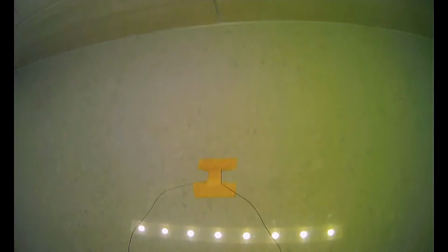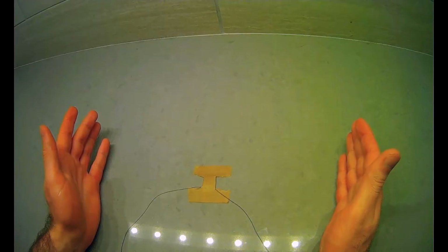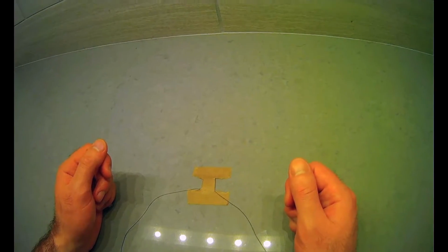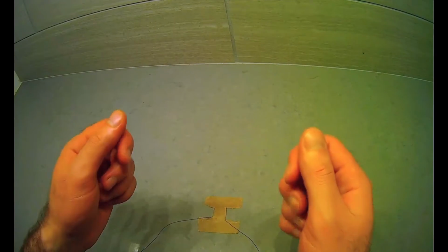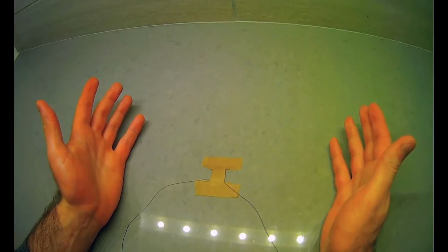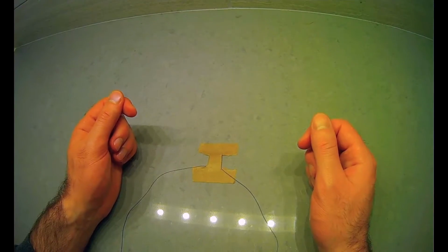The answer to this is that how you want to tie a suture can be context dependent, because it may actually not be practical to use an instrument tie, and you may actually need your hands to stabilize things in order to throw knots as you're tying something into place. A really good example of this is if you're putting a drain in and you're suturing it to the surface of the skin. To instrument tie that into place really isn't very practical, because using your hands actually keeps the drain in place as you're throwing the knots. So the moral of the story is, to be a complete medical student and to be a complete surgeon, you want to be very proficient in both instrument tying and hand tying, because there's a time and place for both.